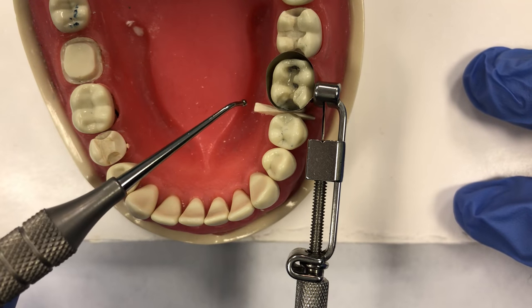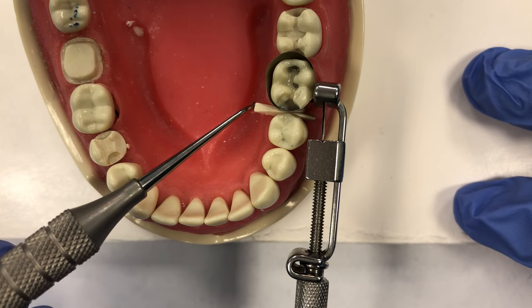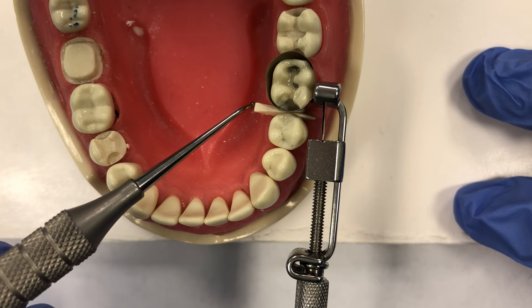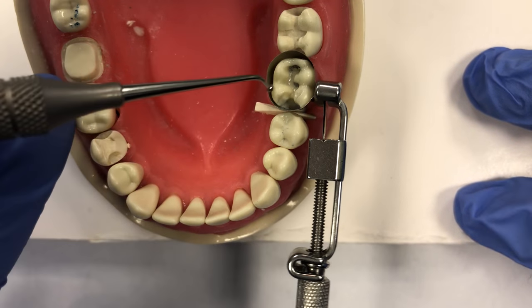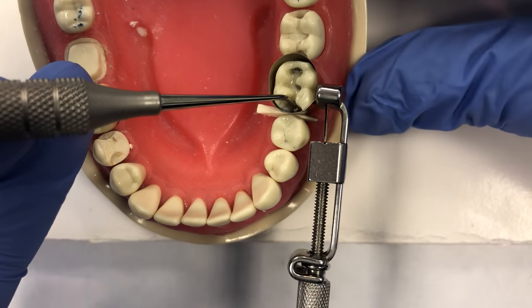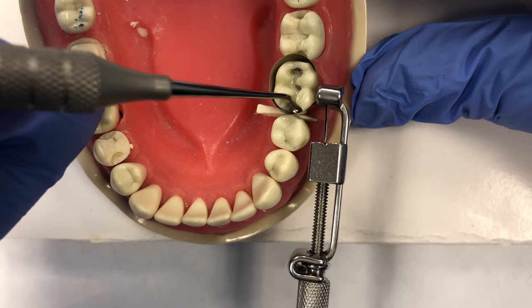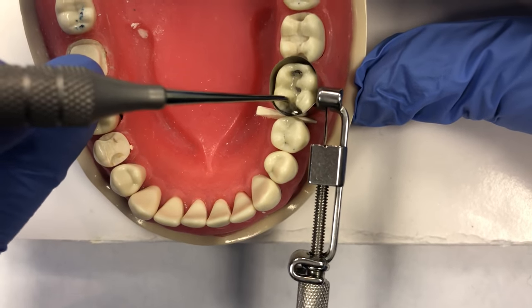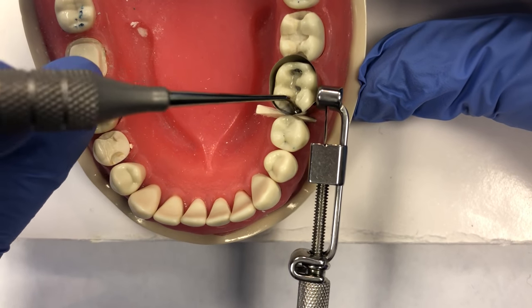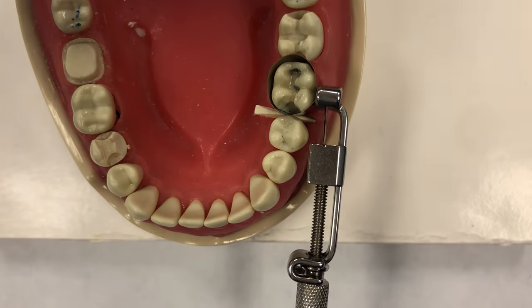Now that the band and wedge are in place, I can do the final step before filling, which is burnishing the band against the neighboring tooth. This wedge helps prevent overhang — it keeps the band snug against the tooth and will prevent the filling from overhanging, maintaining that interproximal shape and space. The burnishing of the band involves pressing and rubbing the band against the adjacent tooth to help create a nice tight contact. We want a tight contact so that when the patient flosses, they get that little snap from the contact, which helps prevent food impaction between the teeth and keeps the space cleaner.